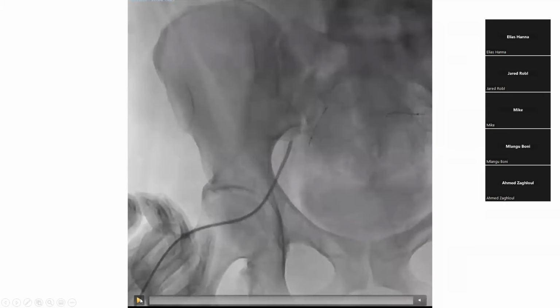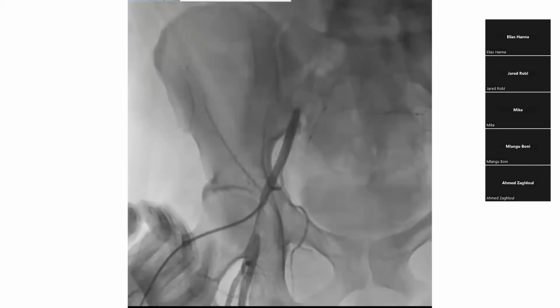Another thing you should always look for that will strongly support your diagnosis is, do they have peripheral disease, the so-called fibromuscular dysplasia? And you can gather that during your initial diagnostic angiogram by doing peripheral iliofemoral angiography. And here they did the case femorally, and look what you see. You have femoral stenosis in a patient without heavy atherosclerotic burden or calcium. This is strongly suggestive in context of fibromuscular dysplasia of her femoral artery, which will strongly support the diagnosis as well.